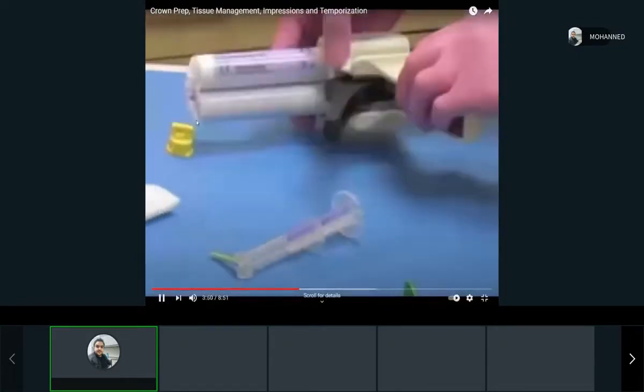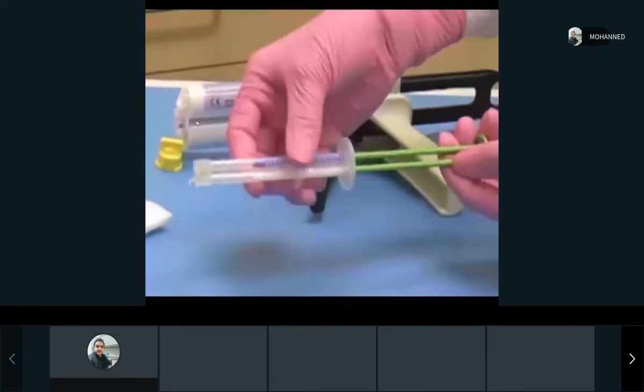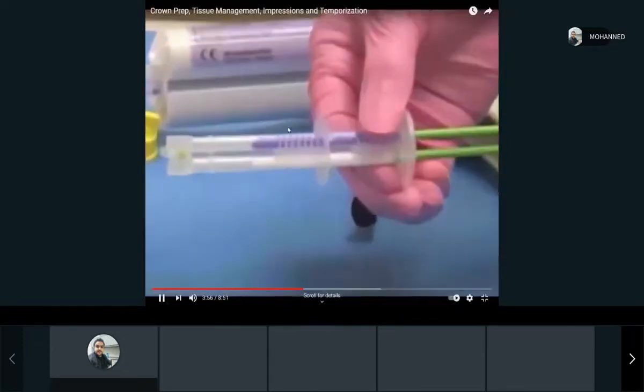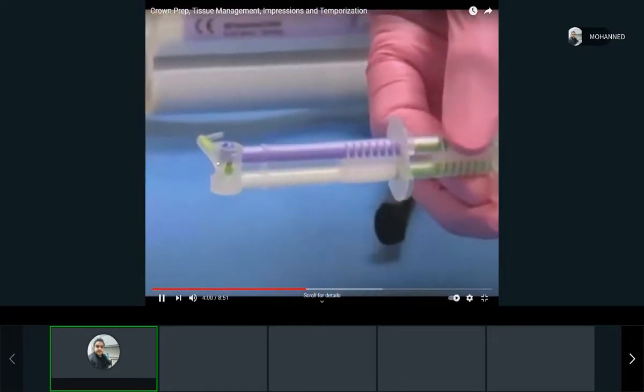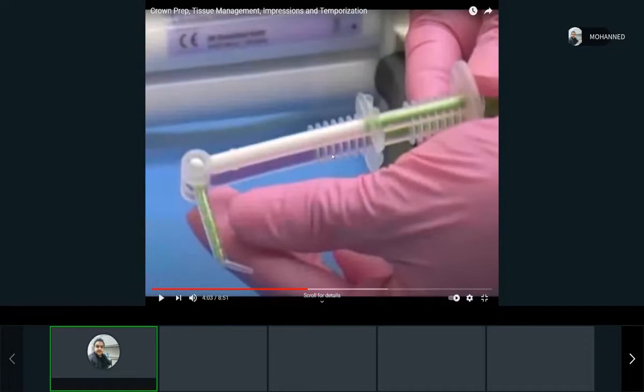See, just like that. So again, this is just for the light body. This is for the wash material.